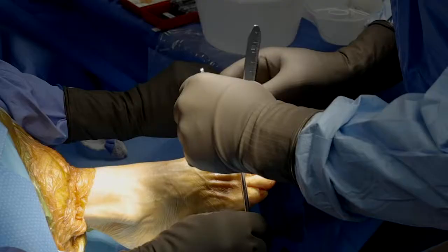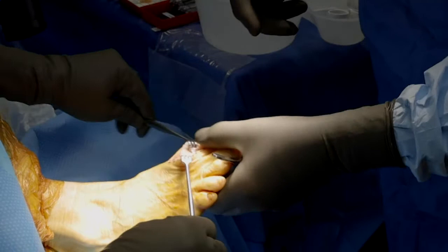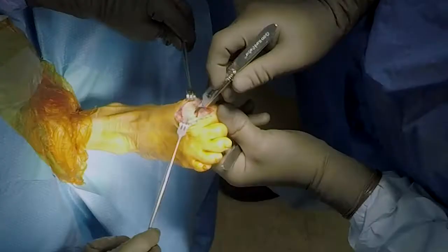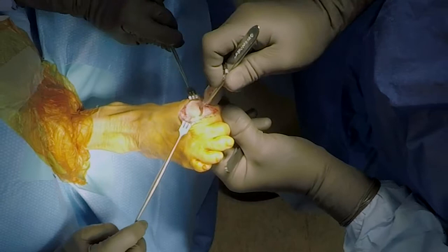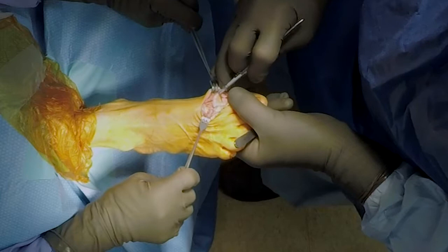Here's a nice little trick to keep everything in a sleeve: I pull up like this and I can actually see the plantar surface. Here's the cartilage defect, the damage. What I like to do then is take the knife and go right into the crista — this is the groove for the medial sesamoid. If I can get my knife in there, I can actually peel and my knife stays right up against the bone.